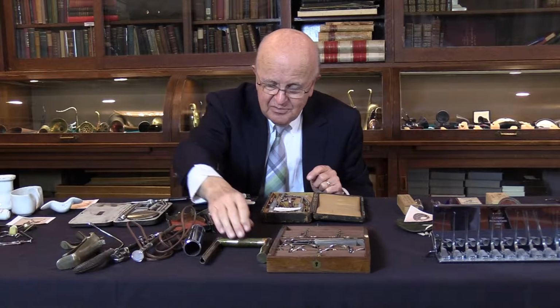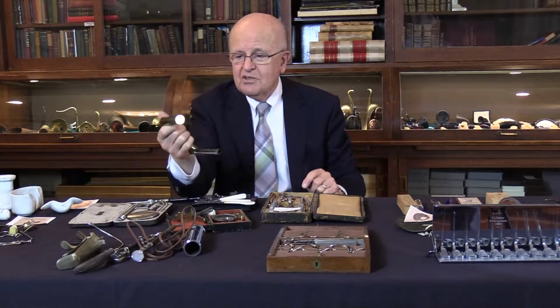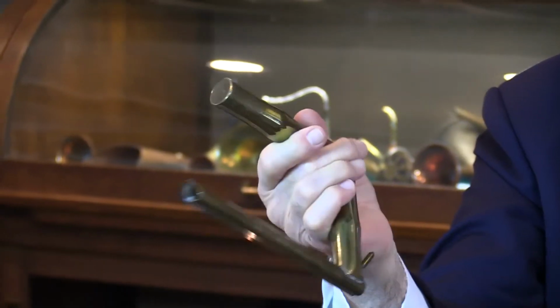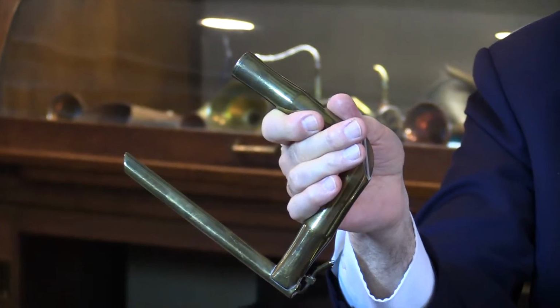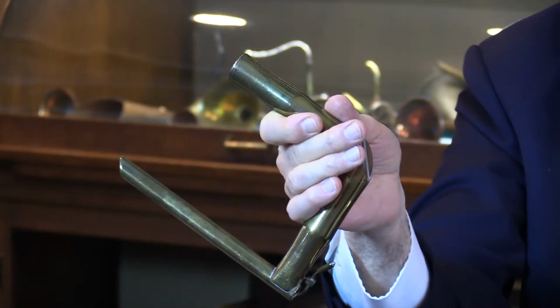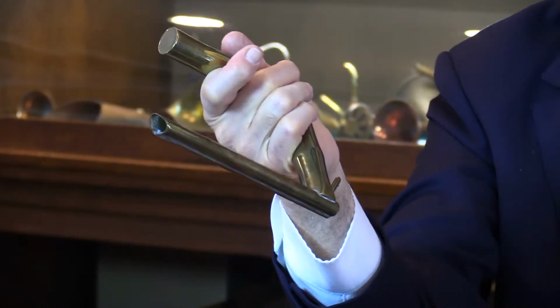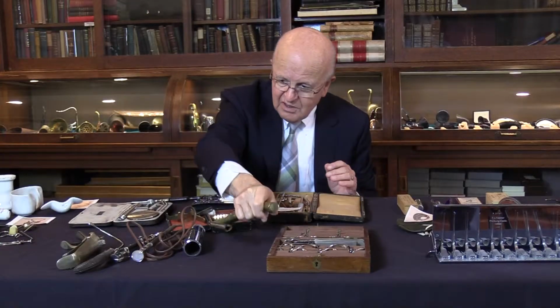This is something that a lot of older otolaryngologists are very familiar with. This is the usual Jackson laryngoscope. The Jackson laryngoscope was the main scope that was used for almost 50 years, 75 years to visualize the larynx.